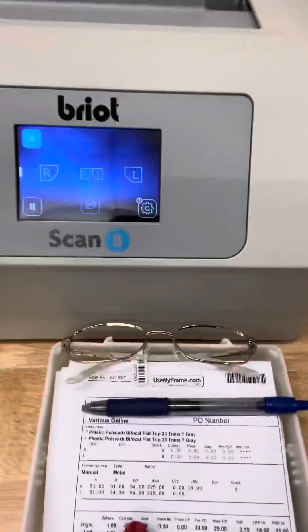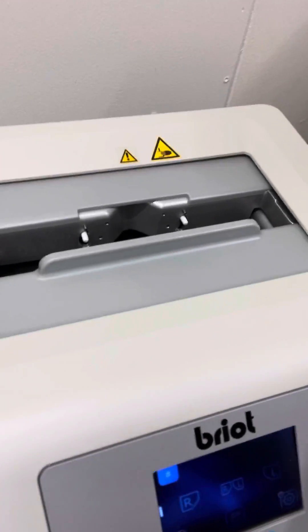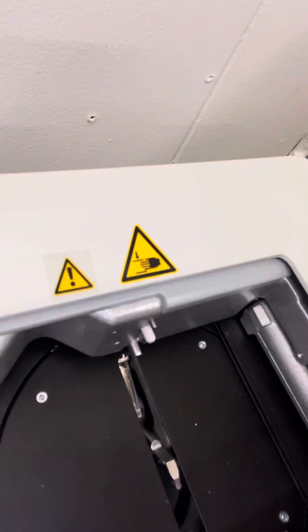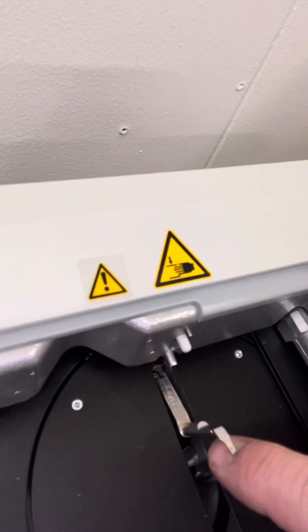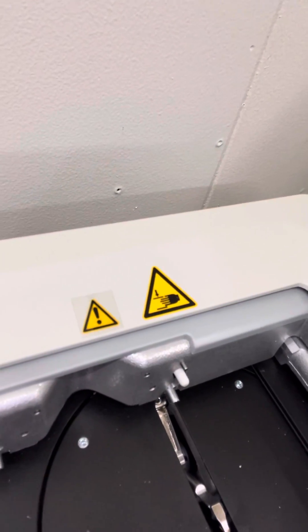Here we have our customer's frame and this is our Briot Scan 8, a very accurate machine. In here is the little stylus that comes up and goes through the inside or the groove of the frame and traces it. It's accurate down to one hundredth of a millimeter.